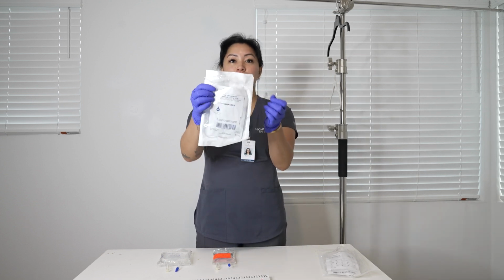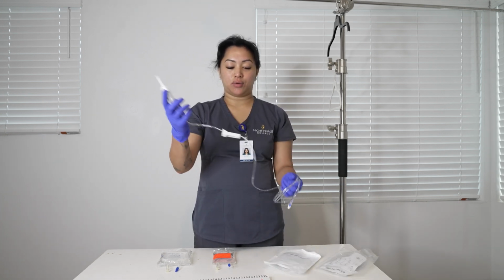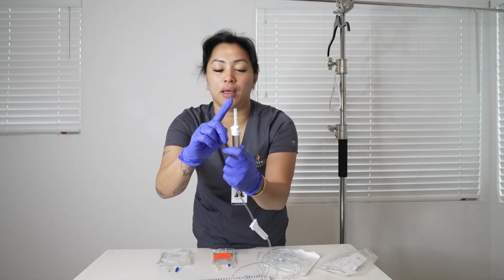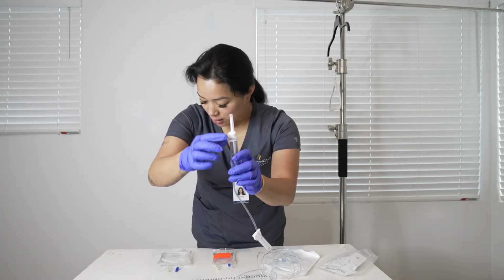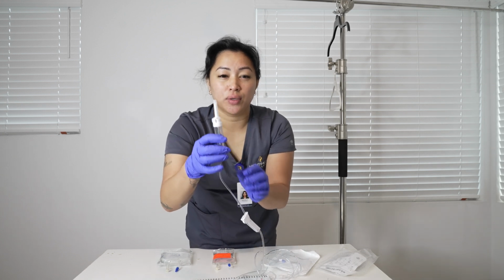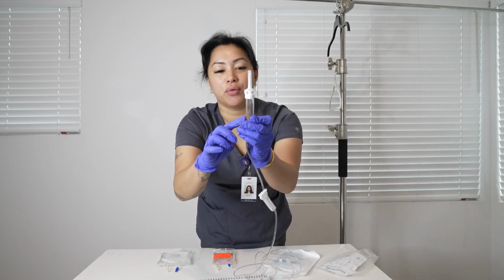So now I am going to talk about my primary tubing. So this is the primary tubing, and I'm going to take it out. And I'm going to start right here. This is the spike, and this has the cap, and this spike goes into the fluid or the medication. This spike is sterile up until I take off the cap and I insert it into the fluid or the medication bag. And then right here is the drip chamber.